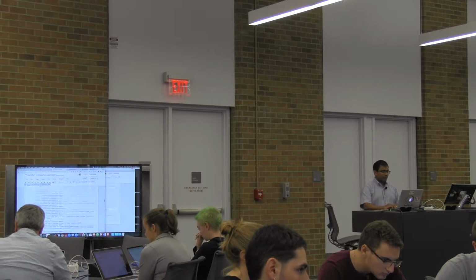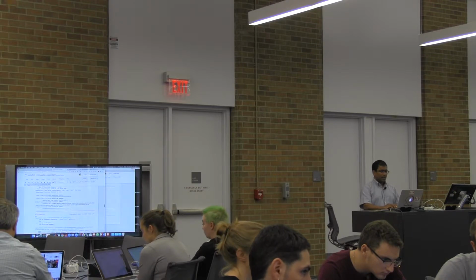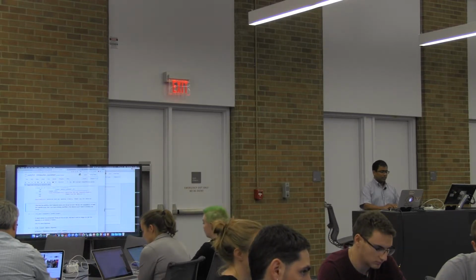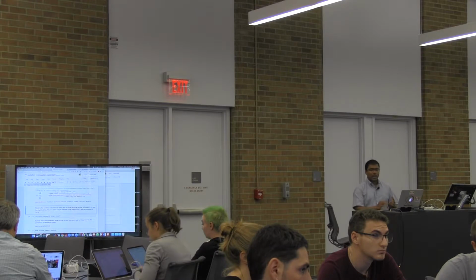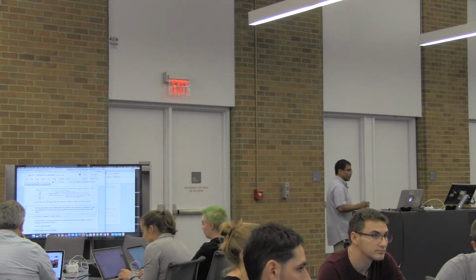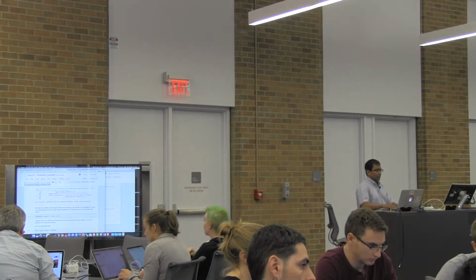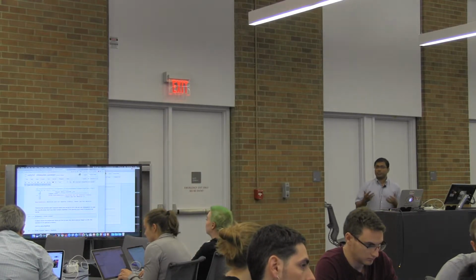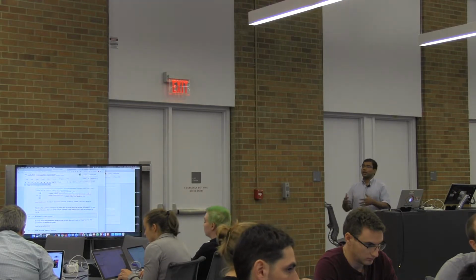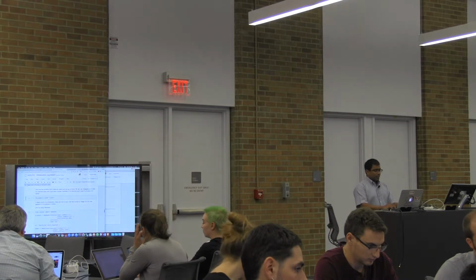And if we do this, I'm going to scroll down. NiPipe says, we have crashed. There's an error. And when NiPipe crashes, it creates a crash file that you can look at. So often we are running these things in an HPC. We are not constantly monitoring these things except during development phases. So we want to look at what happened when things crash. And I'm going to use this NiPipe CLI.